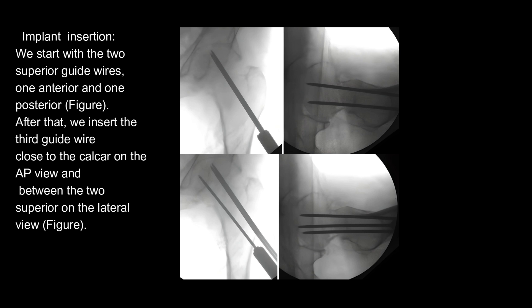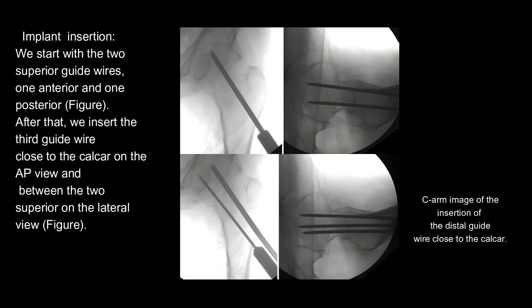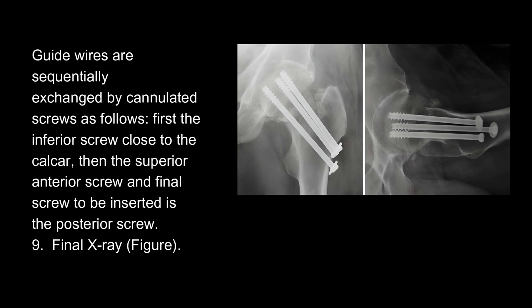Implant Insertion: We start with the two superior guide wires, one anterior and one posterior. After that, we insert the third guide wire close to the calcar on the AP view, and between the two superior wires on the lateral view. C-arm images confirm insertion of the two superior guide wires and the distal guide wire close to the calcar. Guide wires are sequentially exchanged by cannulated screws: first the inferior screw close to the calcar, then the superior anterior screw, and finally the posterior screw.